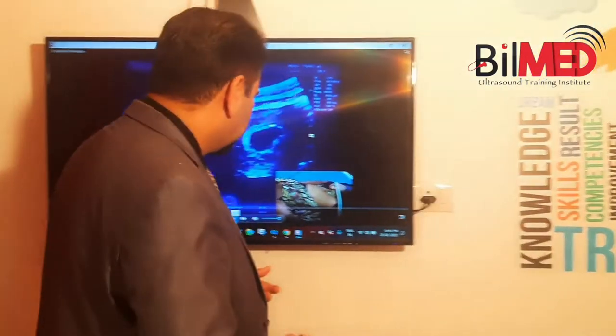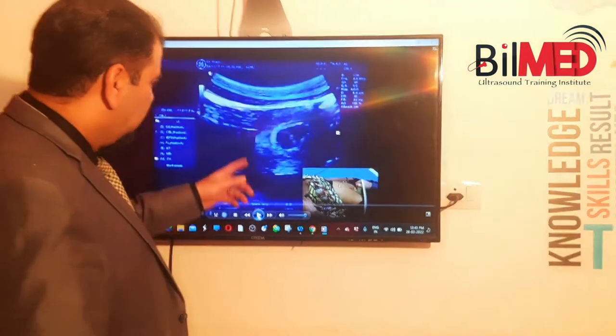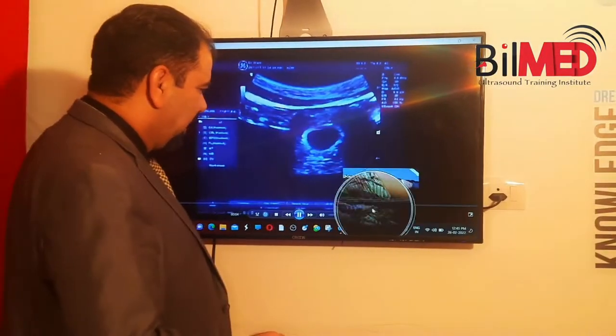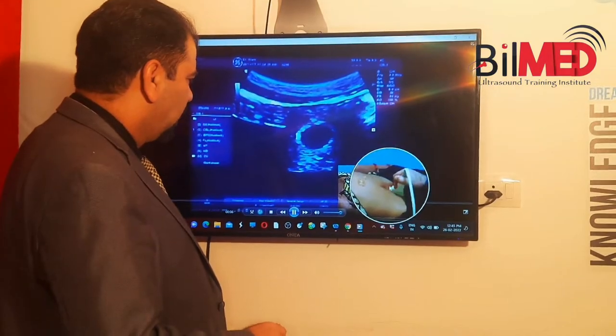Welcome to Bilmed Blocks. Today we will discuss early pregnancy scan — specifically a very small gestational sac. We will see how the chorionic frondosum is identified and what is the significance of knowing the chorionic frondosum. This is a case of early pregnancy where we are scanning live — you can see the live scan going on.